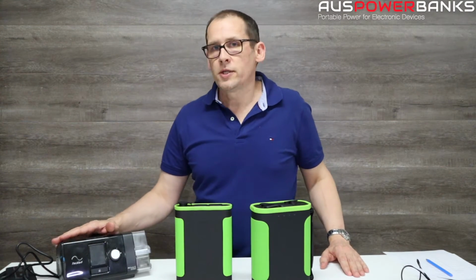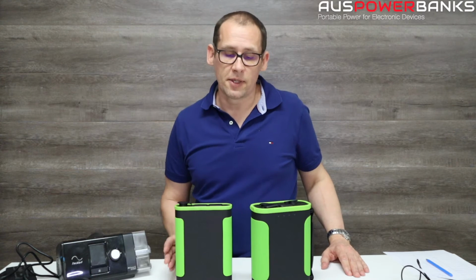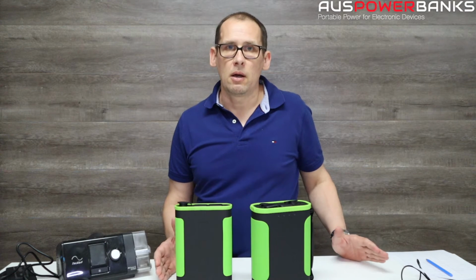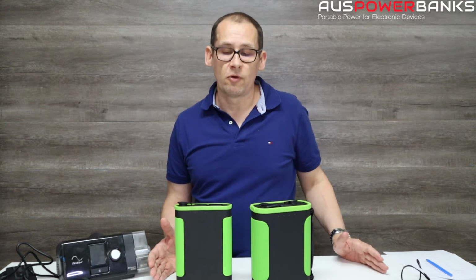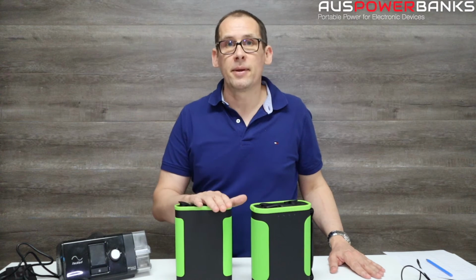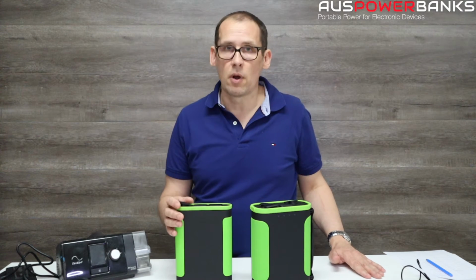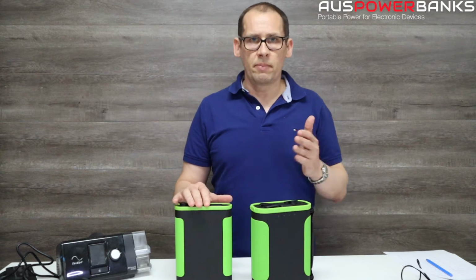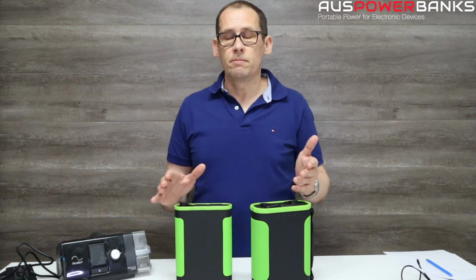Now another big question we get asked is the run times. That's another important one. When you're at home and you're plugged into 240 volt, the runtime is not an issue, it's just constant power. Power banks are different. They're going to eventually run out of power once you use it up. So a very important thing to find out is the power consumption of your CPAP machine.